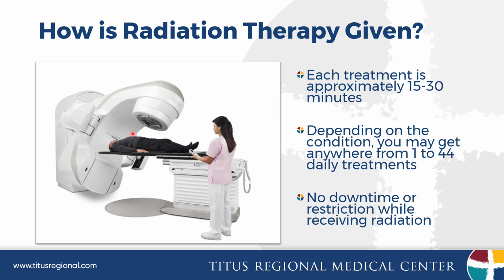As you can see here on the screen, this is a picture of a radiation machine. Commonly we call it a linear accelerator, otherwise known as a LINAC. Typically, each treatment would last approximately 15 to 30 minutes. Depending on the condition, we may deliver anywhere from 1 to 44 radiation treatments. This is a non-invasive treatment, and there's not necessarily any downtime or restrictions while receiving radiation therapy.